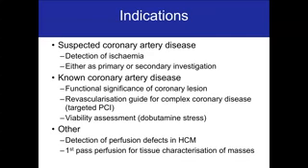Now, what we're not going to talk about in this talk is other reasons why you might want to do CMR perfusion studies, for example, in hypertrophic cardiomyopathy, to look for perfusion defects which could be of prognostic relevance. What we're also not talking about is the first pass perfusion for tissue characterization of cardiac masses, which actually doesn't require the administration of adenosine, for example. This is just a rest perfusion that can help just to look at the vascularization of a cardiac mass.